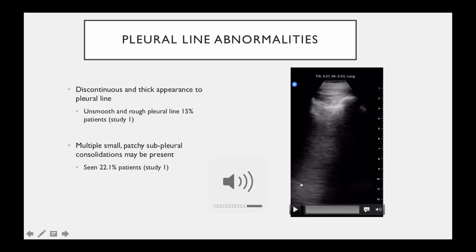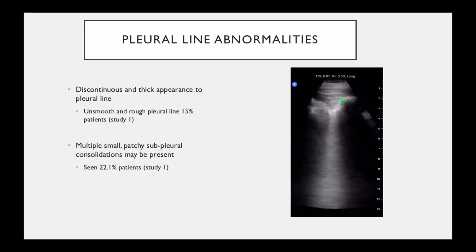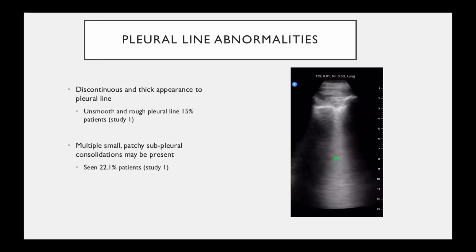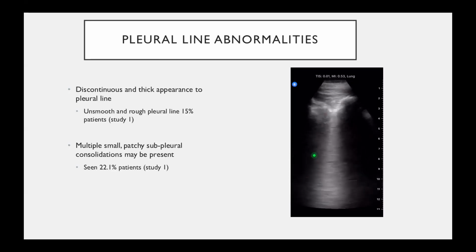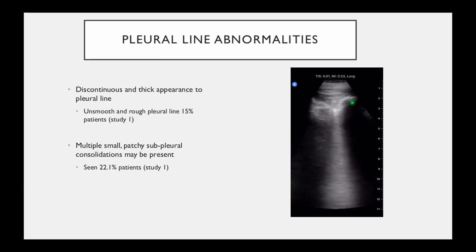This is from Butterfly that shows an example of a patient with COVID infection. This is a lung ultrasound study in a patient with confirmed COVID-19 infection. We are in a lung preset and we see rib here with shadowing and adjacent rib here with shadowing. This is the pleural line, and you'll notice that there is some isolated B lines here as well as B lines there. During the sliding, you can see that there's thickening and irregularity of the pleural line with some discontinuity of the pleural line right there. And this pattern of thickened irregular pleura with scattered B-lines and skip lesions where you have no B-lines in this space between the two B-lines is a characteristic finding that is emerging with COVID-19 infected patients.